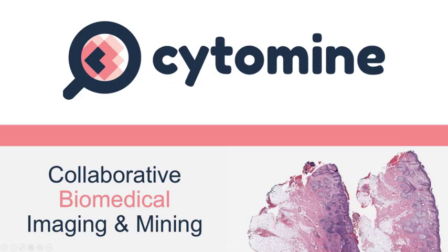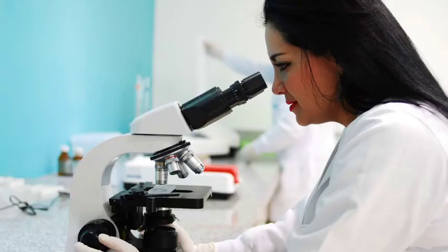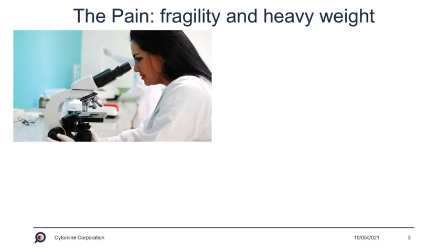Cytomine is a collaborative biomedical imaging and mining solution that focuses on histology and pathology, which are the sciences that focus on observations of cells and tissues with a microscope. The work of a pathologist or a histologist can be a lonely one.